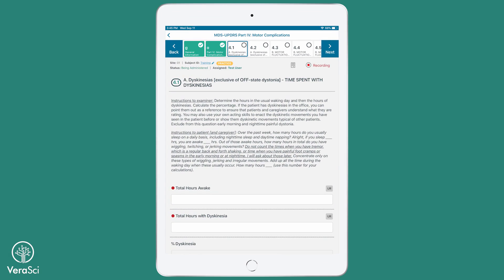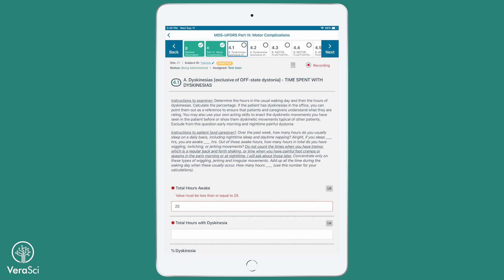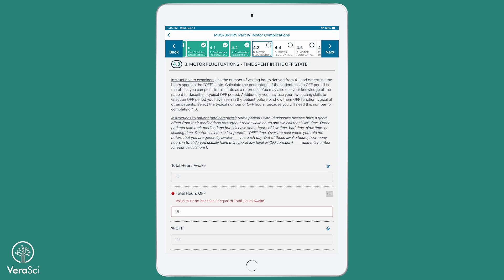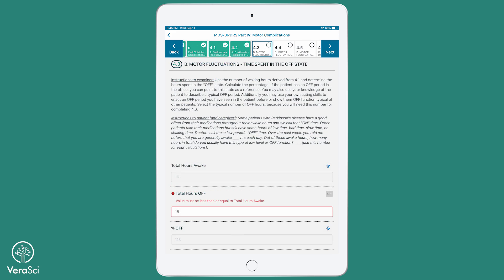Pathway will only accept values up to 24 hours for the total hours fields. If a value is entered that is greater than 24, Pathway will present a message indicating the error. If the clinician accidentally enters a value in the field for total hours with dyskinesia, total hours off, or total hours with dystonia that is greater than the value entered in total hours awake, Pathway will show an error message indicating that the values are in conflict.